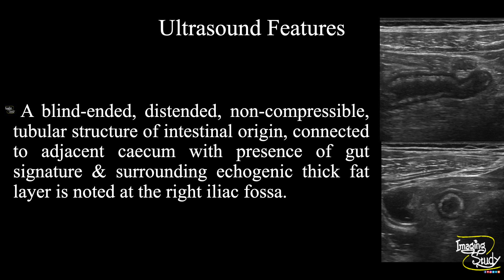So in summary, a blind-ended and distended non-compressible tubular structure of intestinal origin connected to adjacent cecum, with presence of gut signature and surrounding echogenic fat stranding, is noted at the right iliac fossa, indicating acute appendicitis.